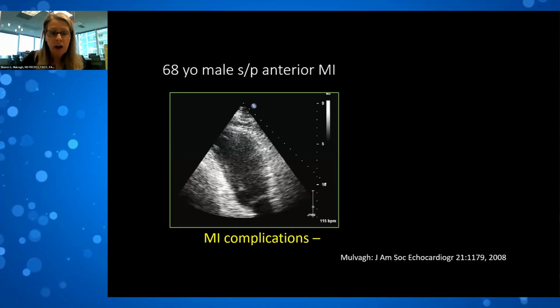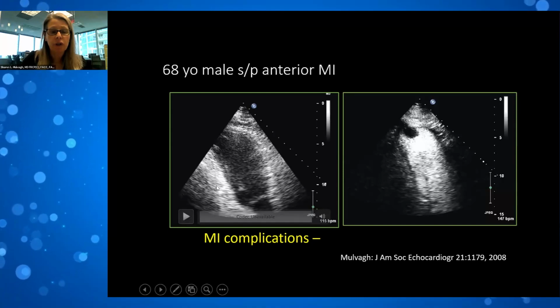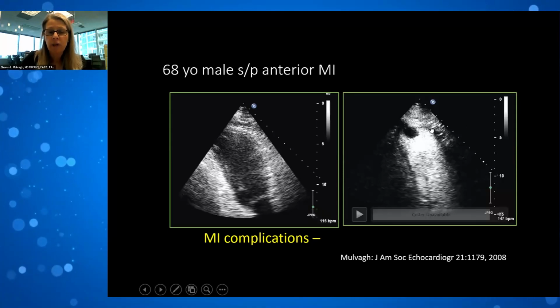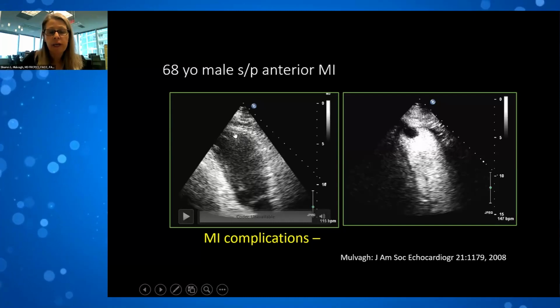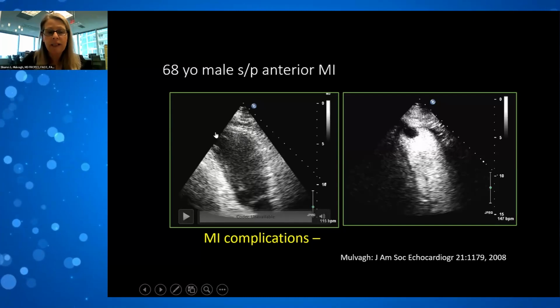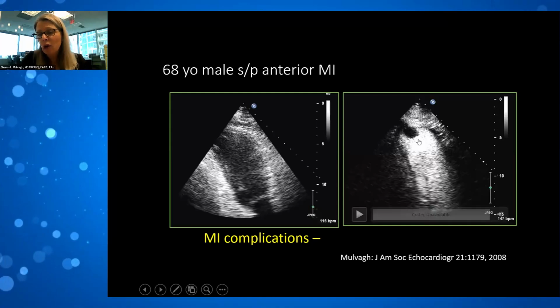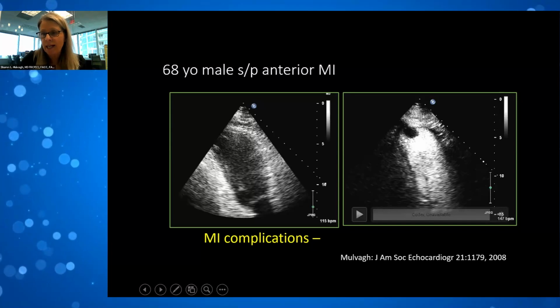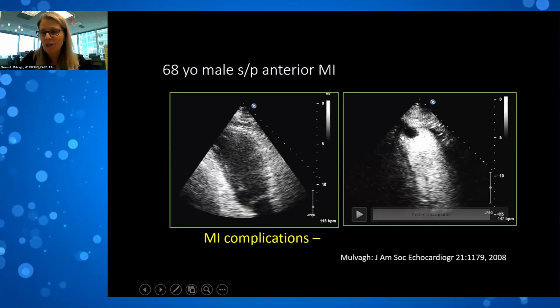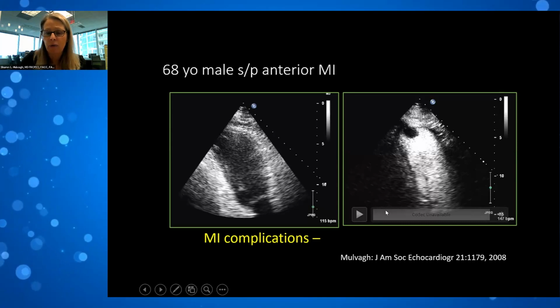Dr. Rabachowski already showed you some nice examples of a left ventricular apical aneurysm, and I'll just go through this quickly. This is a two-chamber view, and I'm sorry it doesn't play right now, but there was a little haziness at the apex. But when you give contrast, you can see clearly that there is a reverse light bulb that stands out with a defined left ventricular apical thrombus.